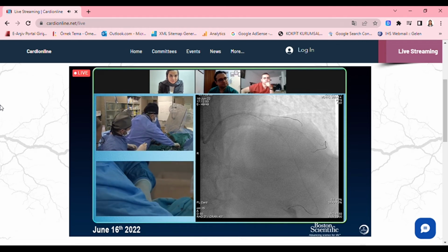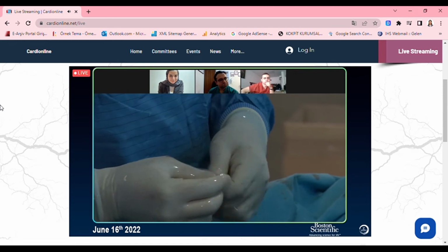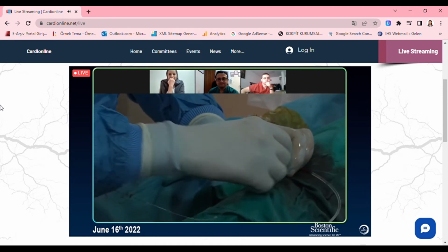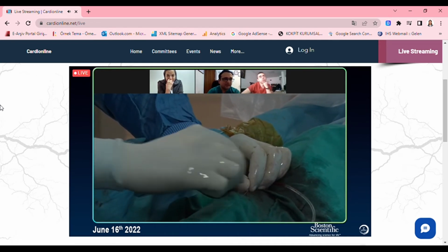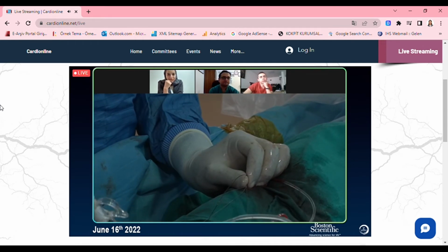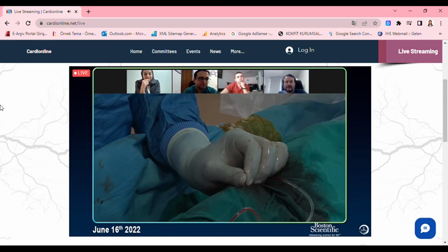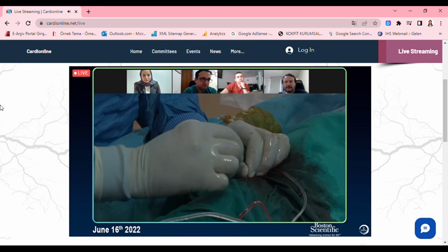My camera has committed suicide, so I'm not on the screen anymore. But I think, guys, it's important to see that the part is not that well opened, right? There's a bit of waste. That's why I like to touch with the 3.5, Rasha. If I would go directly to stent after 3, I wouldn't see that expansion.